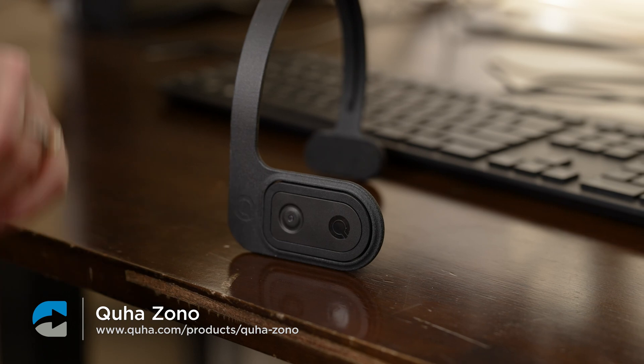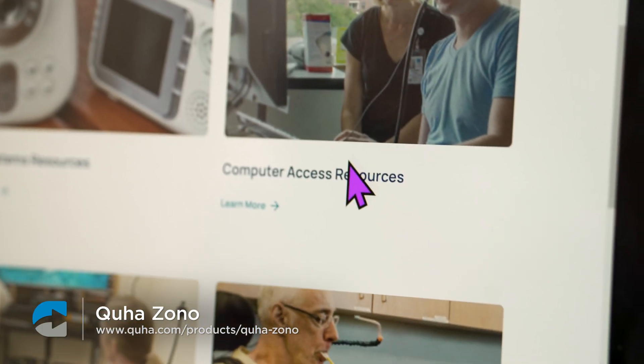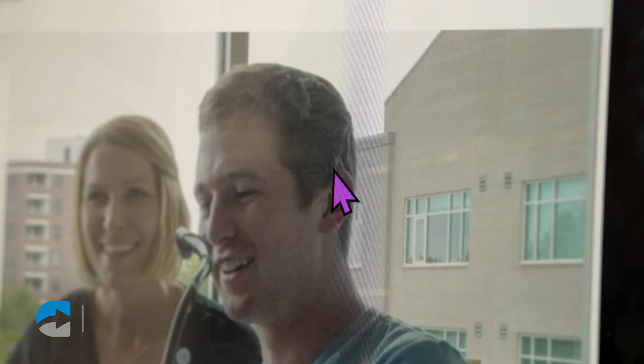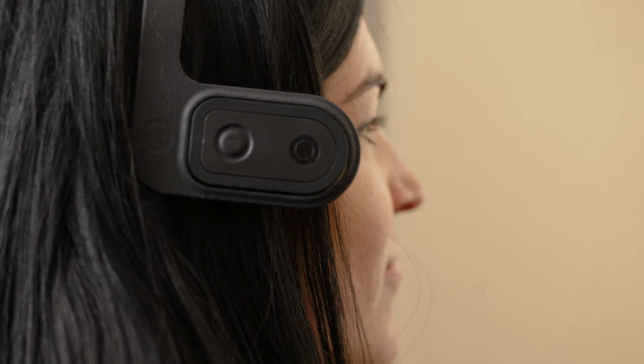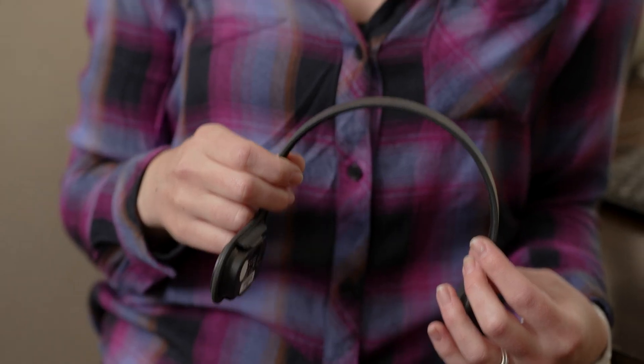The Quha Zono is another head mouse option. This is a gyroscopic head mouse, so you would put this on your head, and then you would click in a similar way by hovering over an item to select it. They also have an option for add-ons that would include a way to click using a sip or a puff or an external switch.